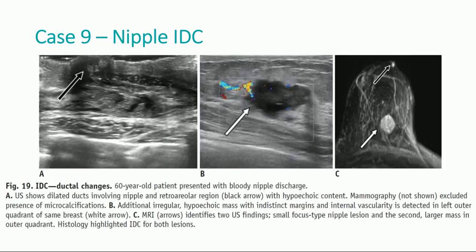Nipple invasive ductal carcinoma in a patient that also presented with bloody nipple discharge. The ultrasound shows a dilated duct involving the nipple and the retroareolar region with hypoechoic content. The mammography excluded the presence of microcalcifications. An additional mass with suspicious characteristics was detected in the left outer quadrant of the same breast. The MRI identified both lesions that were later confirmed as invasive ductal carcinoma.